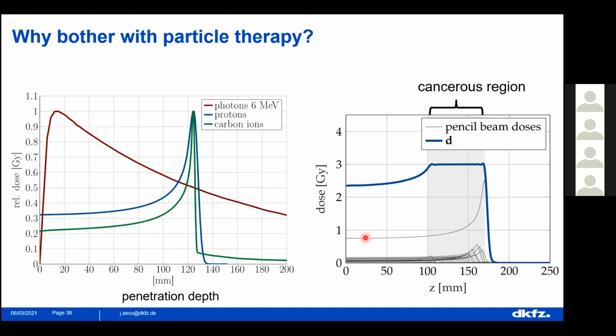Okay, here are the different types of Bragg peaks for different types of ions compared to the photon. I've already shown you the photon to protons. I haven't shown you the carbon ions yet. So the green line is the carbon ions. They also have a Bragg peak. The Bragg peak is much sharper, and it produces a very large fragmentation tail, depending on the energy of the carbon ions, of course. So here's the key slight, let's say, disadvantage. This fragmentation tail does create a lot of biological dose, and you have to pay attention to it.